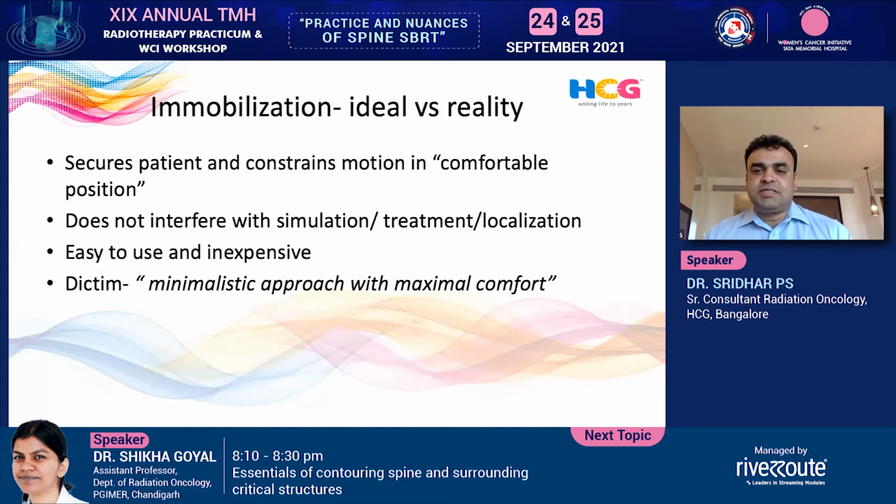Coming to immobilization, it's always a challenge. So this is ideal immobilization versus reality. When you see the CT scans or the images, these are all static images. It is like a dead patient, but the patient is always dynamic. So you need to keep that in mind always.